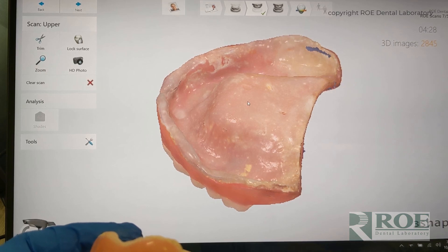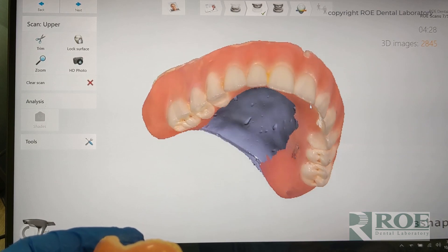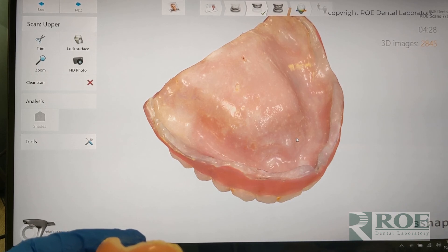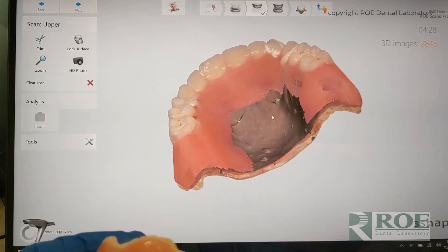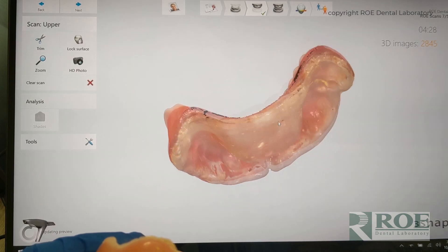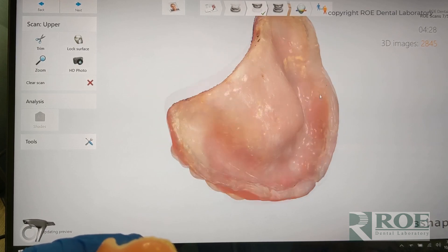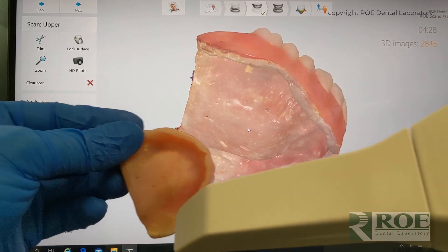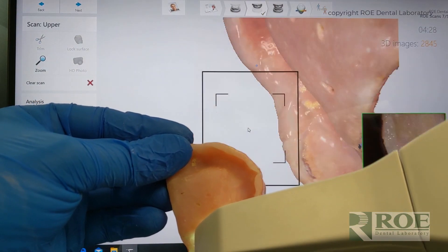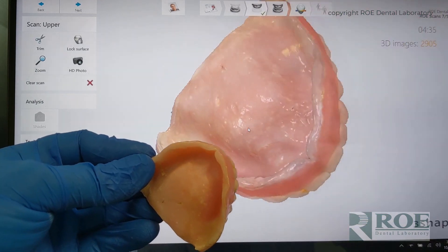We're going to go back and fill that little void in there. Other than that, this is a perfect scan. The reason we don't need the palate is because we can make a virtual model and the software can determine the palatal material — just like we do with any denture where we have a stone cast and put wax in. The software can take the negative and make the palate. It's a really smart way to do these. Let me go back and scan just this little area here to fill in that void. The scan is done.